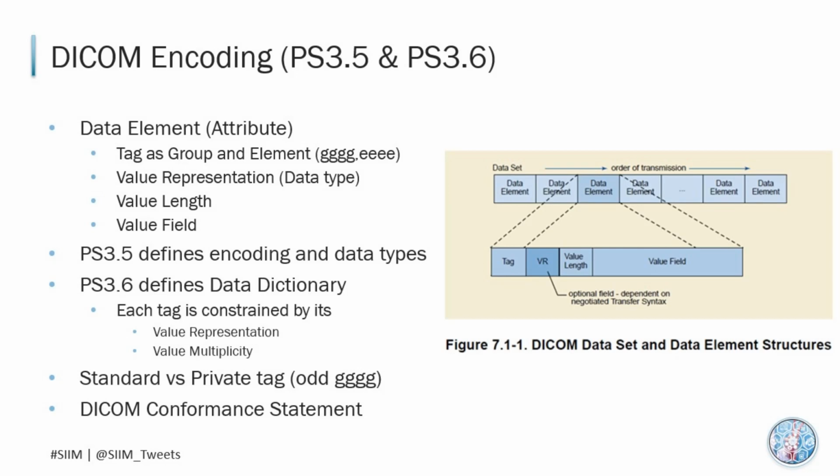Oh, nice. It's good to know that there's a rhyme and reason for how that metadata is organized. So I recall from our previous conversation that there are big concerns around PHI, which do exist in DICOM headers. Are there any best practices that I can follow to avoid ethical issues around personal health or other identifying information?